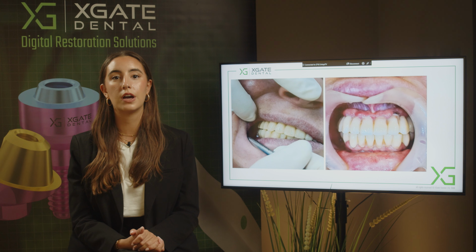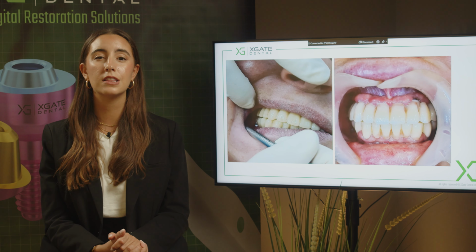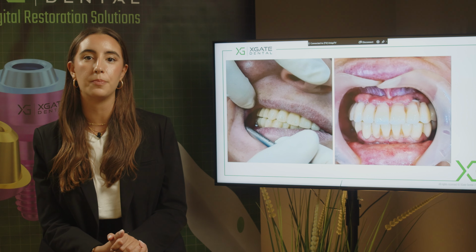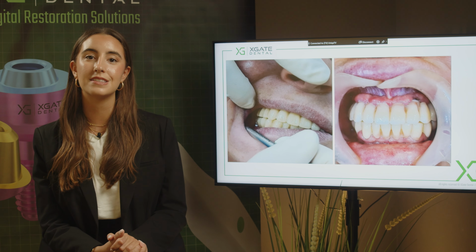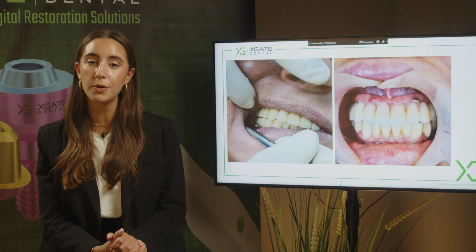You can see that the central line of the lower bridge is probably a little bit shifted because it's on her own teeth, and it's a little bit of a problem to move it to the right of the patient. You can see that when she smiles, it's very symmetric and it's parallel to her smile. The only thing that we changed a little bit was the design.